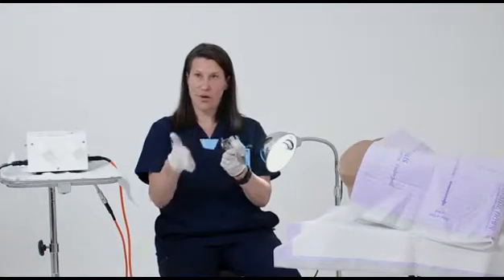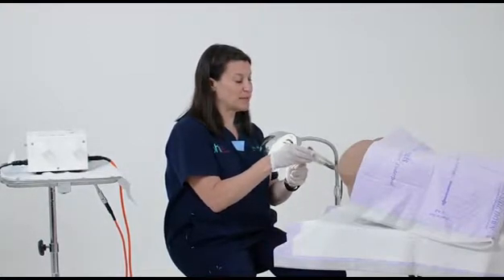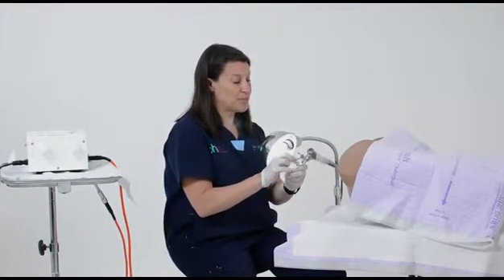One trick is to take a condom, and then you can open up the speculum so that the vaginal walls won't dip in and it will be easier to protect them.